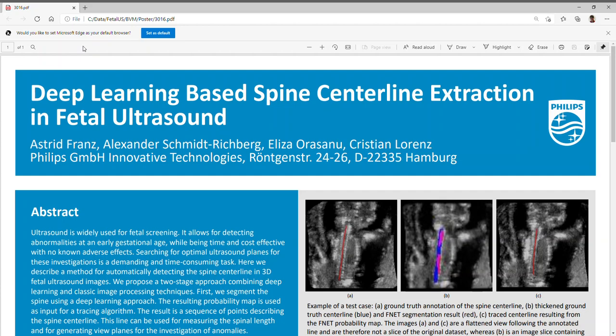First, we segment the spine using a deep learning approach. The resulting probability map is used as input for a tracing algorithm. In this way, we get a sequence of points describing the spine centerline. This line can be used for measuring the spinal length and for generating view planes for the investigation of anomalies.